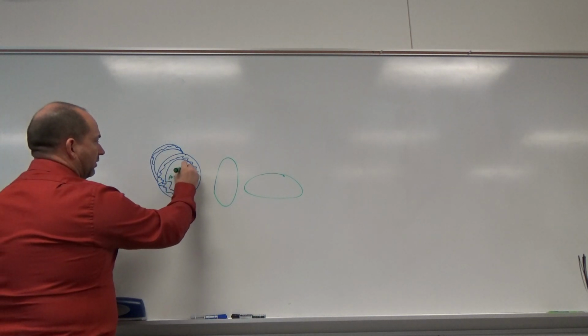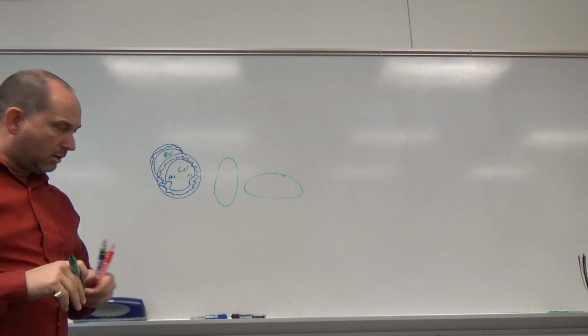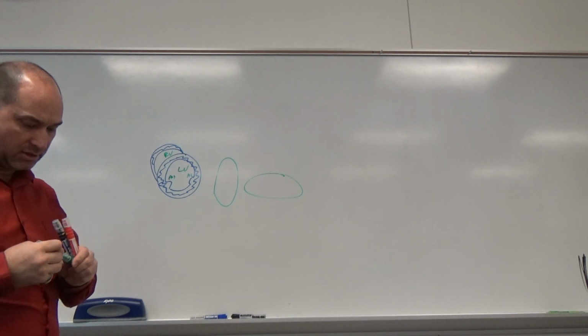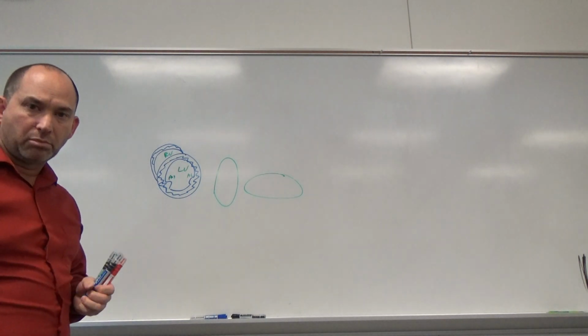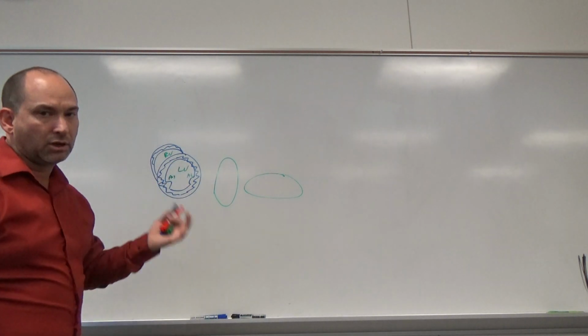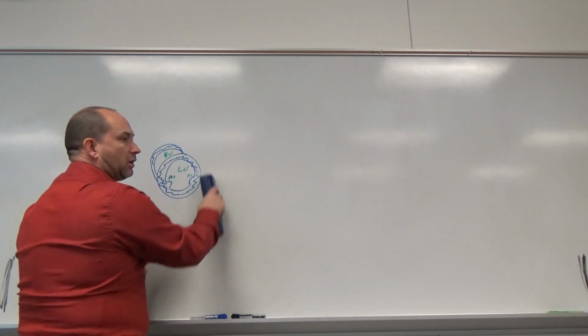This is LV, this is RV. Okay, you take a 2D clip of that, making sure that you see the inner walls really well, because we're going to be gauging people's myocardial perfusion based on how well those walls squeeze. So we're looking at the squeeze of the wall, meaning you have to see the wall. If it's dark and hazy, you need to get a better image.